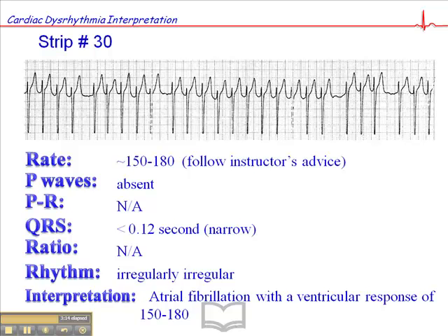And I will sometimes do that when I'm dealing with a rapid AFib because the treatment for rapid, unstable AFib is different from SVT. And so you want to be able to make that distinction.